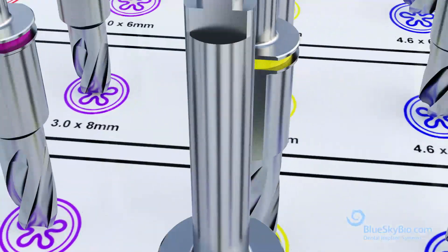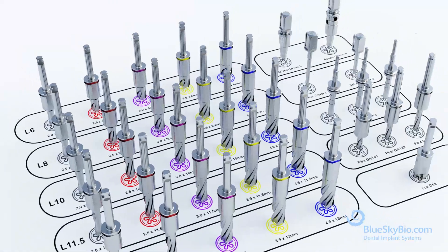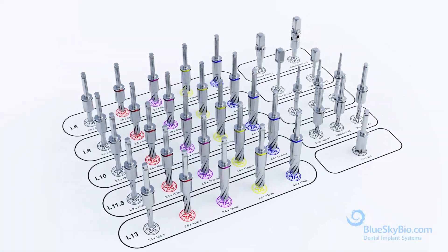The BlueSkyBio Fully Guided Keyless Kit is a simple, ideal solution for guided surgery that offers maximal ease of access by eliminating surgical keys.